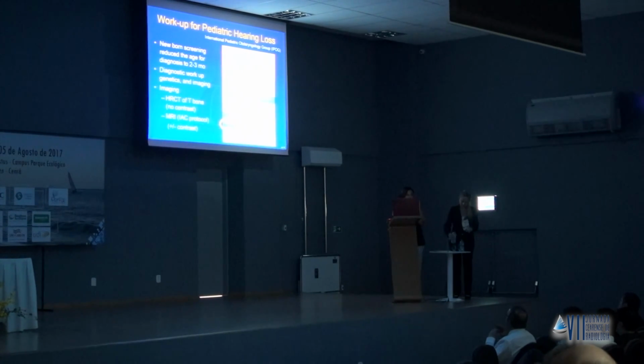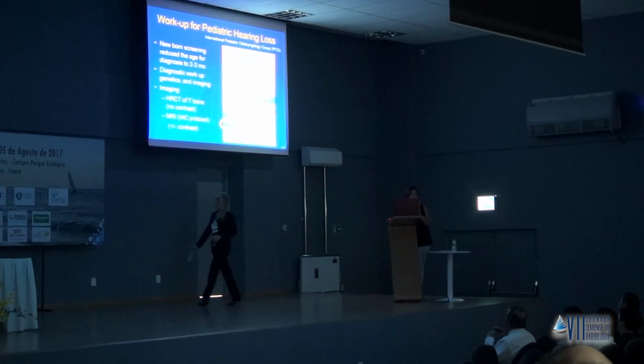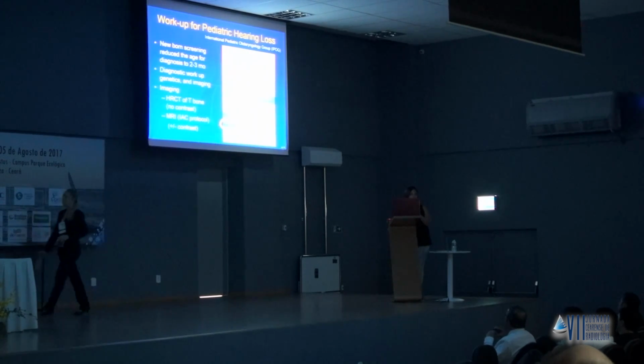Diagnostic workup includes genetics quite a bit at this point, and when it comes to imaging, high-resolution temporal bone CT is the first line of imaging when necessary. And this can be further complemented with MR imaging, focusing on the region of the internal auditory canals.